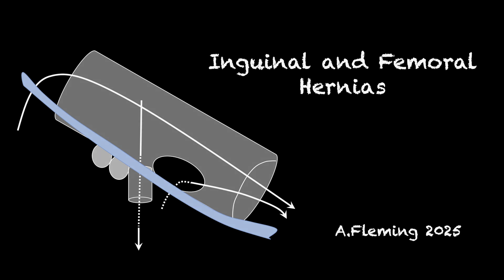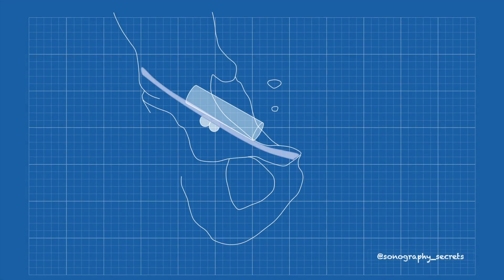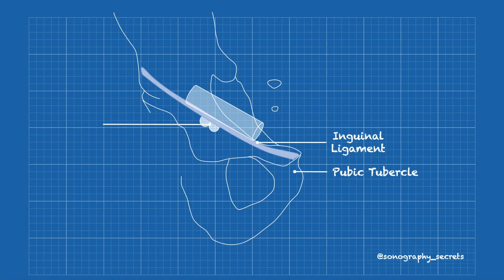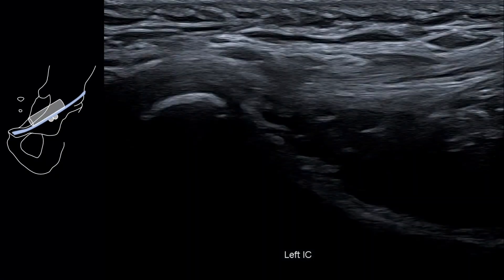The key to ultrasound of inguinal hernias is in the identification of landmarks. If we cannot identify these specific landmarks, we cannot identify the inguinal canal, and if we cannot identify the inguinal canal, we cannot identify an inguinal hernia.